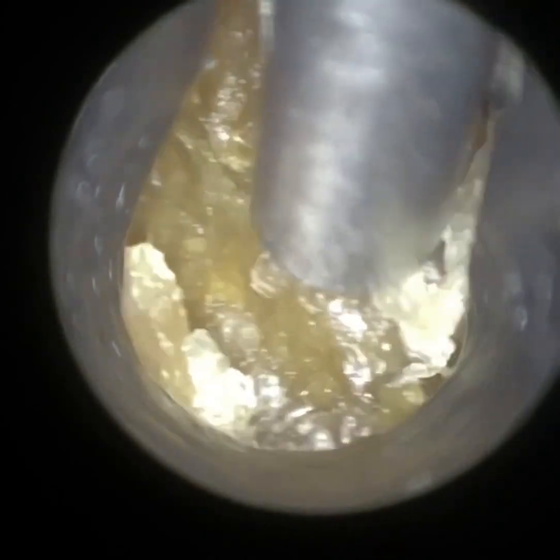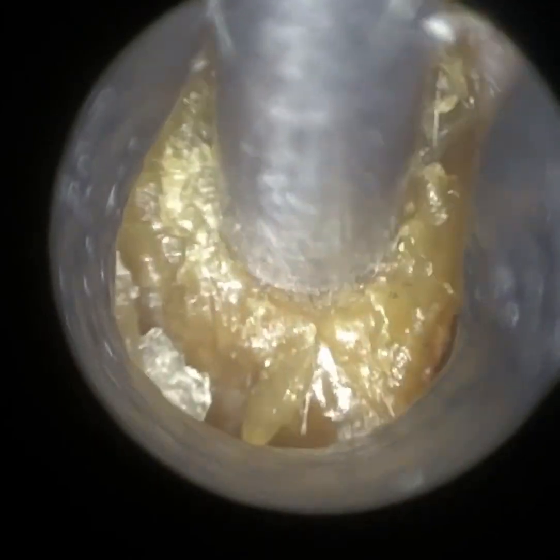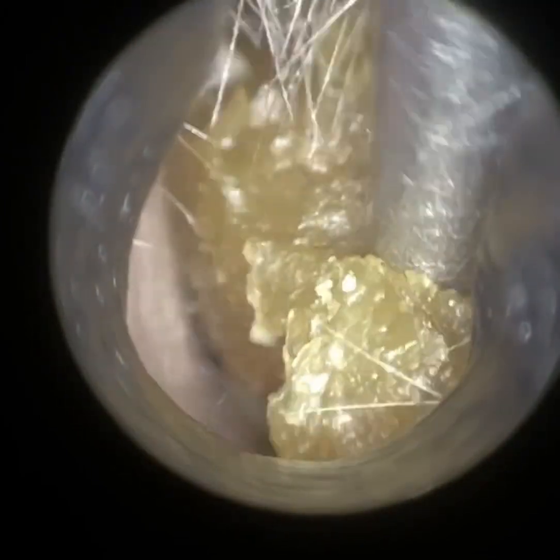I have a patient here who attended with bilateral fully occluding earwax. We're just commencing in their left ear and I'm using our 4.25mm speculae. I've just dilated and straightened the patient's auditory canal. I've adjusted the focus so we can see the wax and instrument really clearly, and I'm just using the sucker to slowly but surely manipulate this wax out of the ear canal. You can see it's just coming past the first bend as we speak.